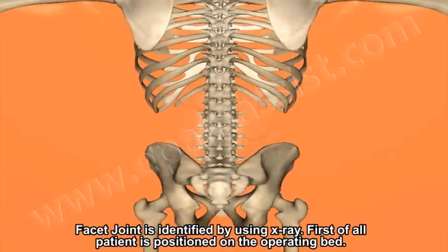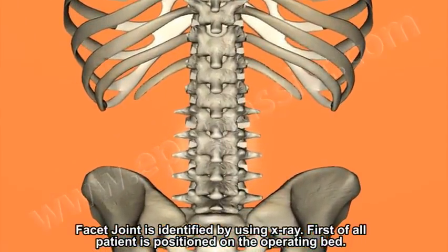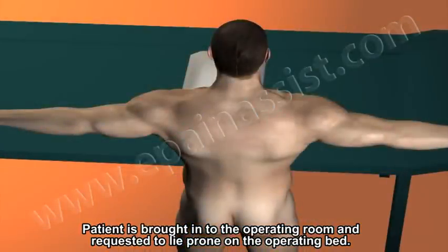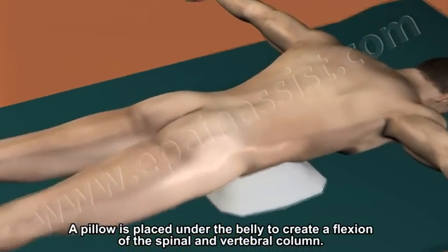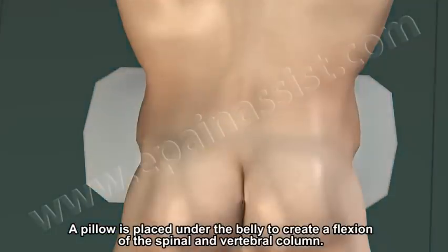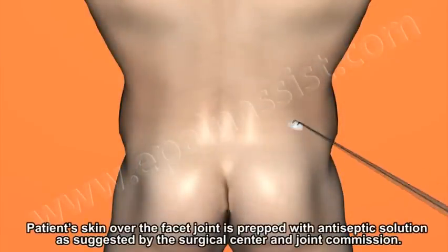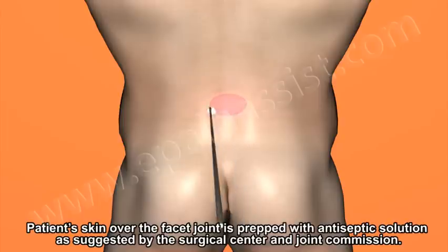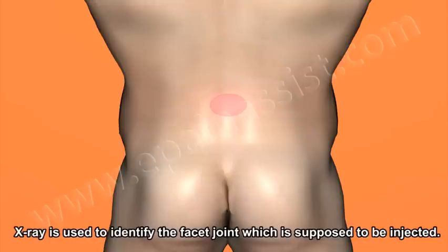Facet joint is identified by using X-ray once the patient is positioned on the operating bed. Patient is brought in the operating room and requested to lie prone on the operating bed. A pillow is placed under the belly to create a flexion of the spinal and vertebral column. Patient's skin over the facet joint is prepped with antiseptic solution as suggested by the surgical center and Joint Commission. X-ray is used to identify the facet joint which is supposed to be injected.